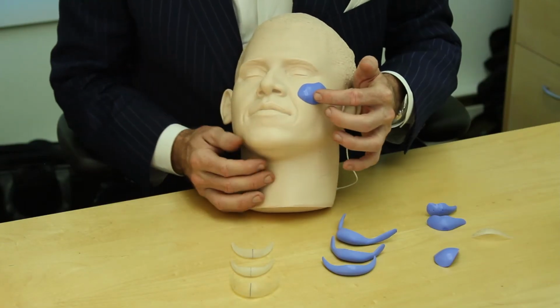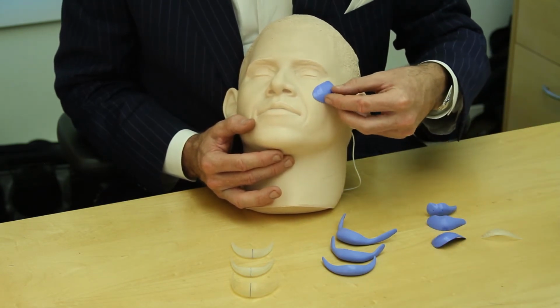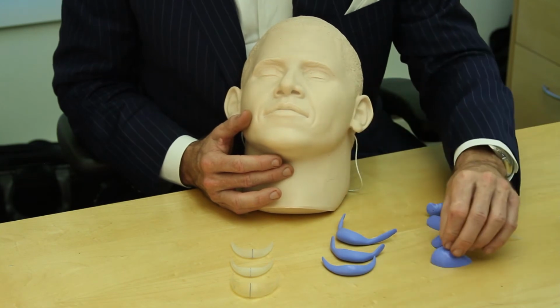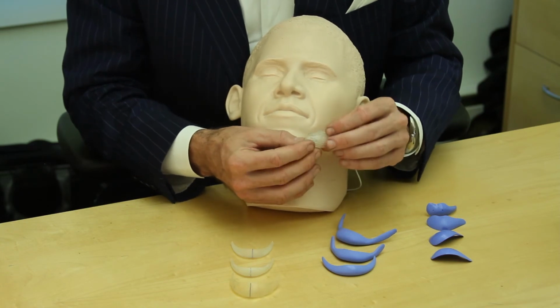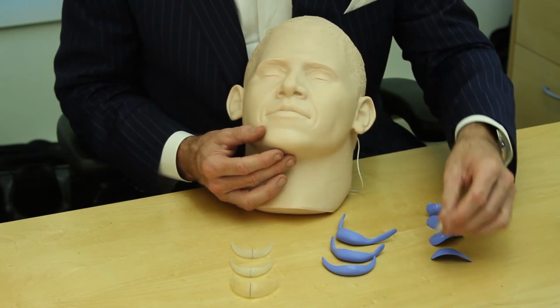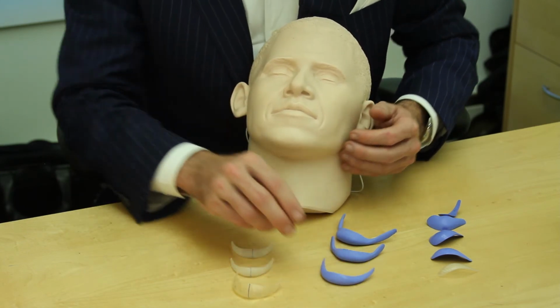And if we wanted to remove this implant, we could certainly do that. And again, just going through the inside of the mouth, there's a good approach to grasping it and pulling that implant out. So I have a box that I use of different sizers. I'll fit the patient specifically for the size and shape that they need. There are virtually an infinite number of sizes and shapes to these implants. And this is an actual implant, a cheek implant that would be used for malar augmentation. And the other part I can do is simply customize them. I can actually trim these implants when we're placing them so that they're fitted nicely and give the right amount of contour but are not too big or too small for the individual patient.